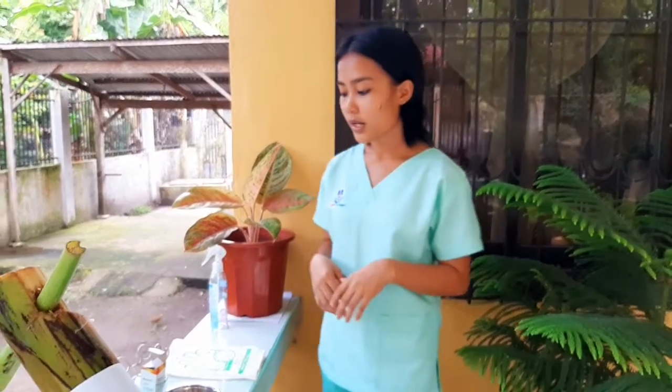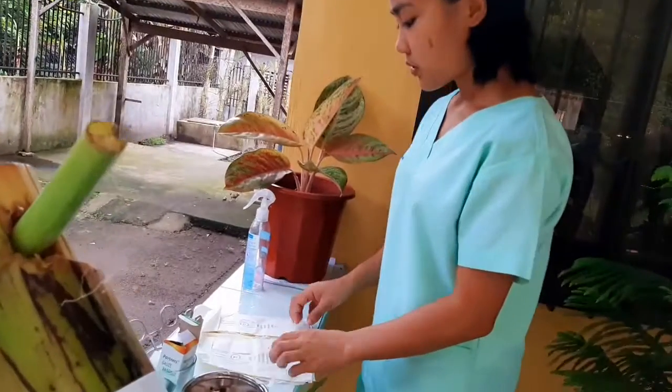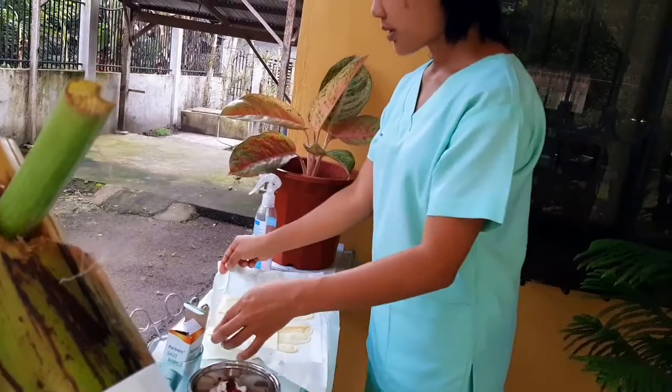For a wet-to-dry dressing, pour the prescribed solution into the sterile basin. After pouring the prescribed solution, we can put on clean or sterile gloves. So same as before, make sure not to touch the sterile area.